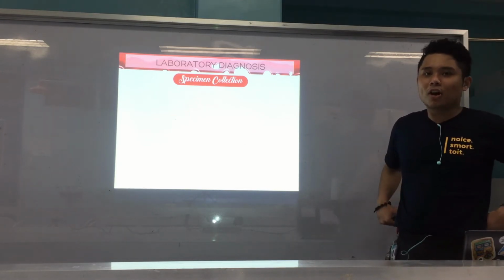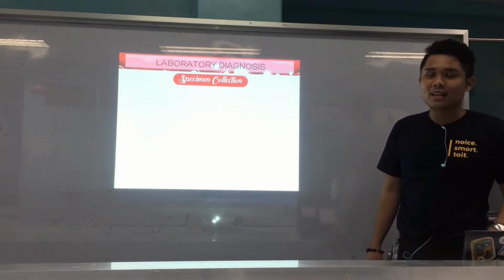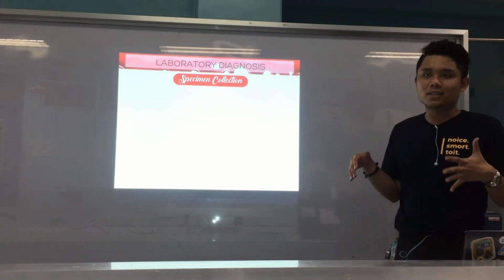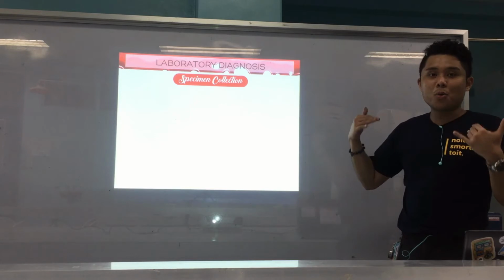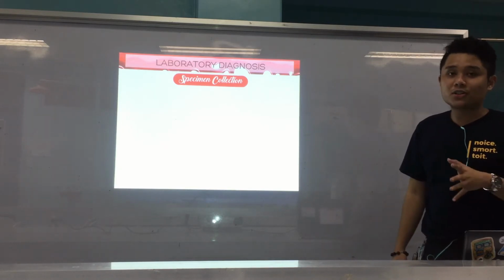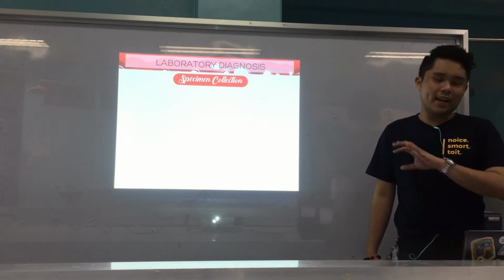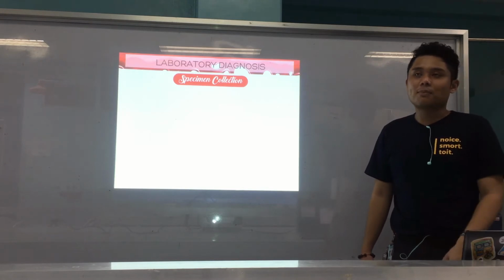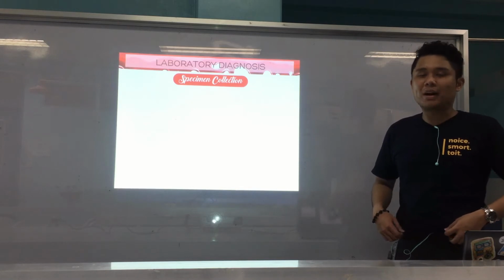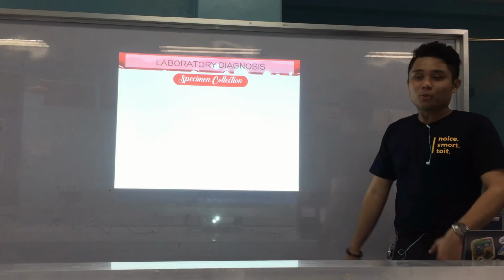So that's why we are talking about blood culture, because again, under normal circumstances, it's a sterile site. Blood and all your internal organs usually are sterile. Your fluids, like pleural fluid, peritoneal fluid, and CSF, all those are considered sterile. So the presence of any pathogen there, except in cases of contamination during collection, usually plays an important role. And the presence of bacteria in those sterile sites usually leads to infection. That is why we're talking about this, okay?